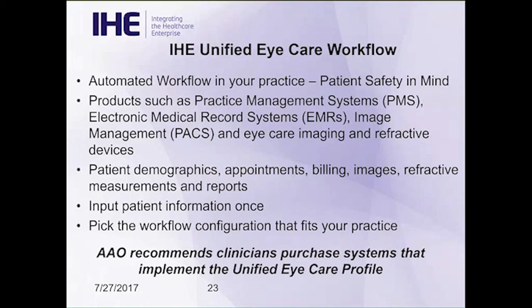And lastly, the AAO recommends clinicians purchase systems that implement unified eye care. The AAO is really pushing very hard that we think our users need to purchase these systems because it's proven to work well. And don't forget, we have a process called a Connectathon, as we talked about before, that enables the vendors to come together and test. So have you tested your system in the Connectathon is very important. And then, of course, showing it at an AAO demonstration helps show that to the clinicians.